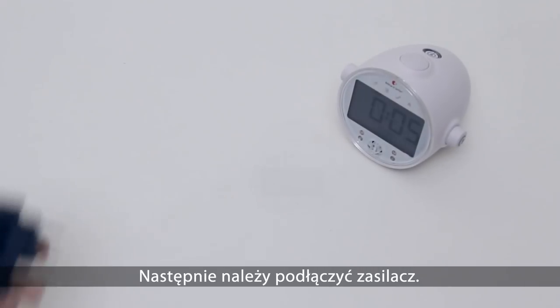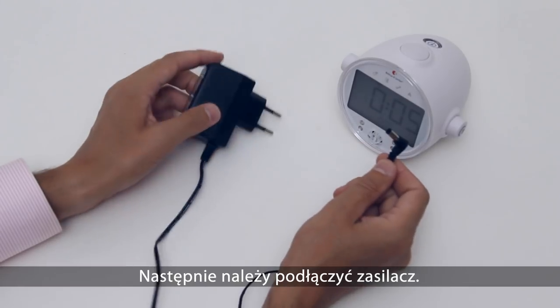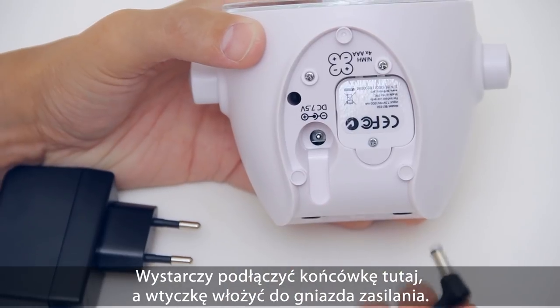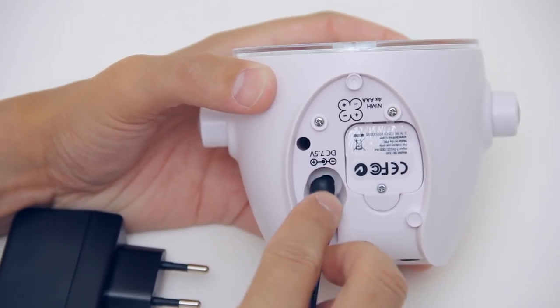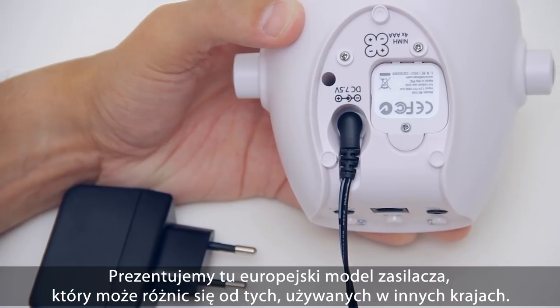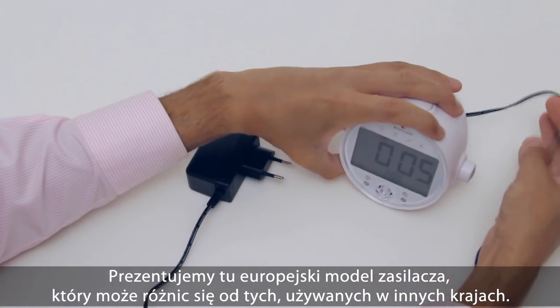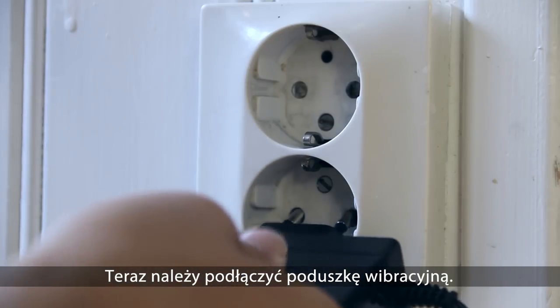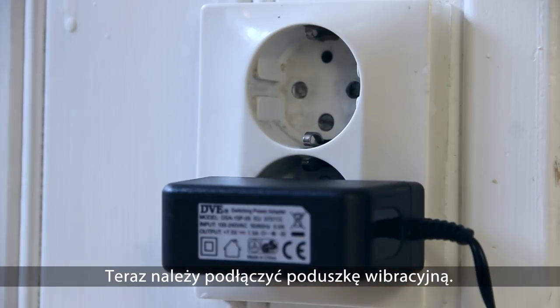The next step is to plug in the power adapter. Just connect this end to the jack here, and connect the other end to the power outlet. I'm showing a European power adapter, and it may differ from the one in your country.